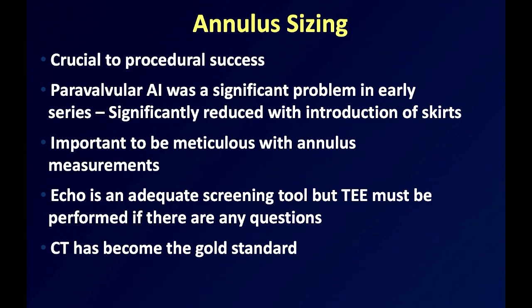And the new valves we use right now actually have a skirt that prevents paravalvular leaks. It is important to be meticulous with annular measurements. Echo is an adequate screening tool, but TEE must be performed if there are any questions.